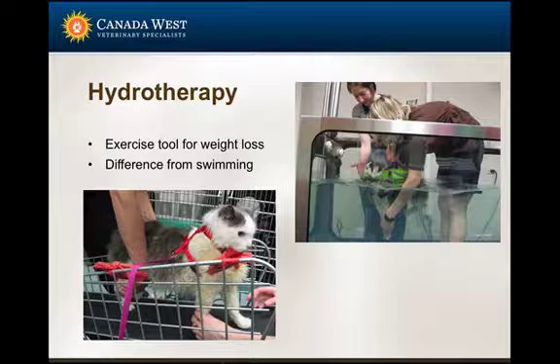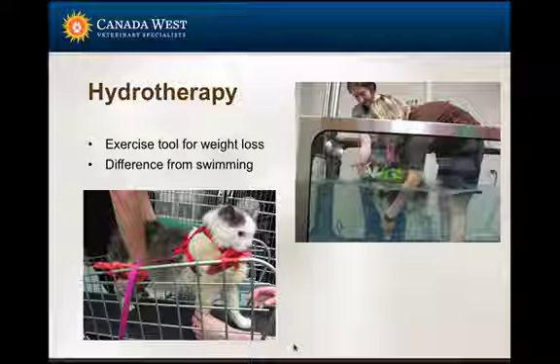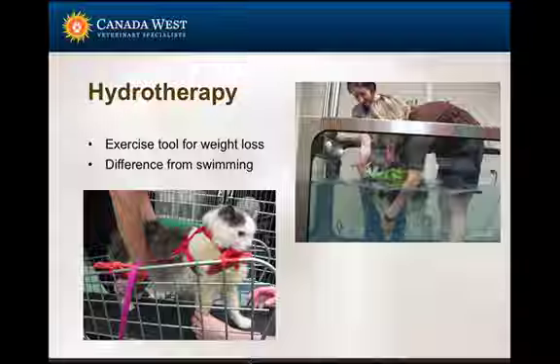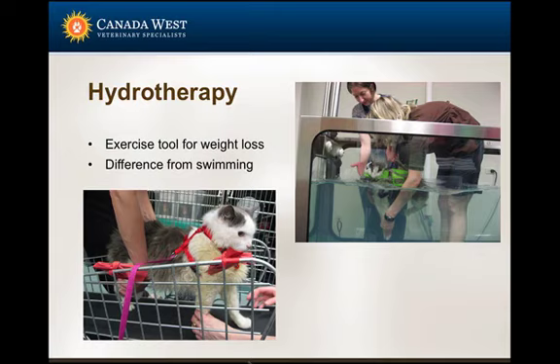We use both a dry land treadmill with him to again help with this patterning of walking and learning how to move. And then he also goes in the treadmill, and we have a little life jacket for him, and we work his legs, and so he swims. I don't think all cats would tolerate this. I do think that Rover's had just a little bit of diminishing of his faculties.